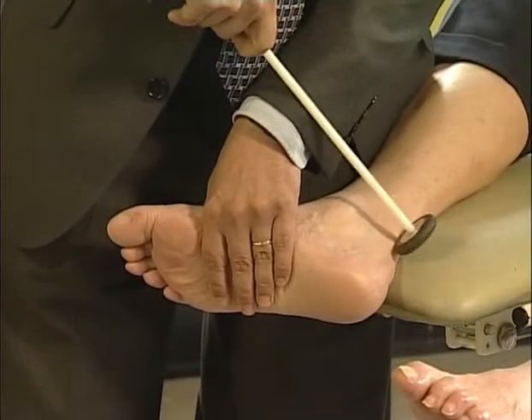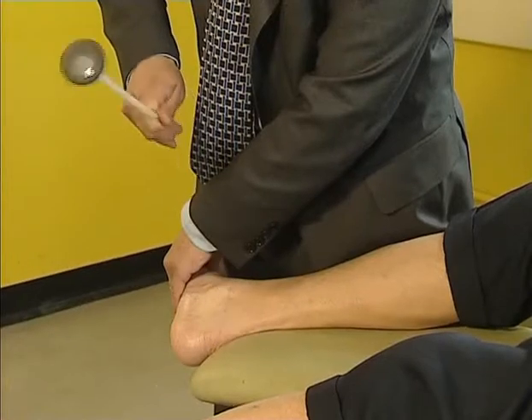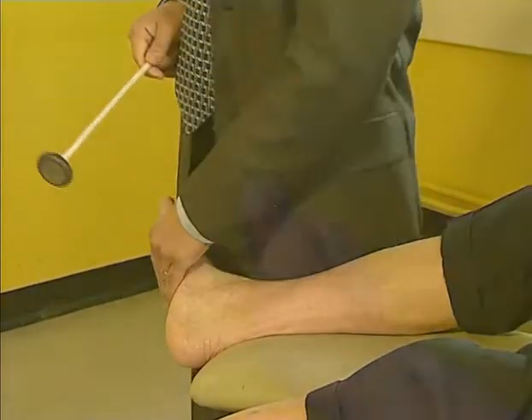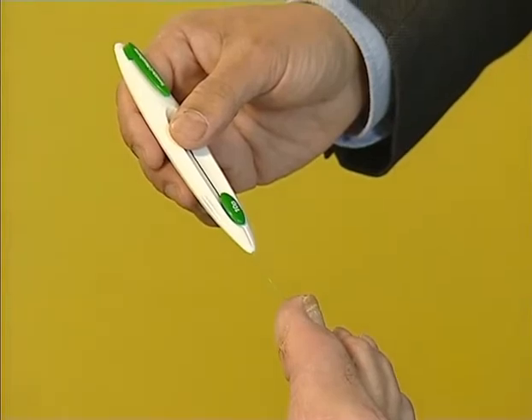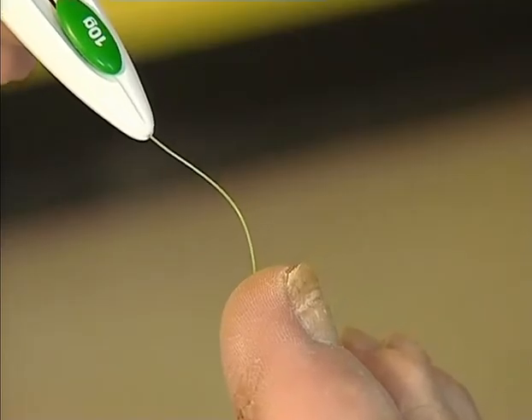A patella hammer may be used to test for motor function, but tells us little of loss of protective sensation, which is more important. If only one test is to be chosen to screen for peripheral neuropathy, we would strongly recommend the use of the 10-gram monofilament.